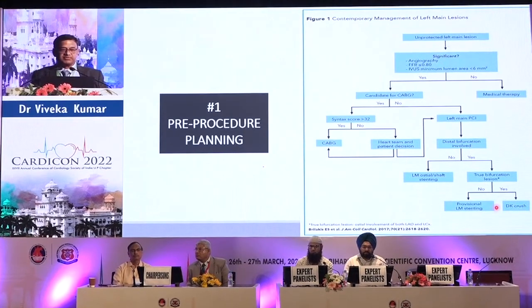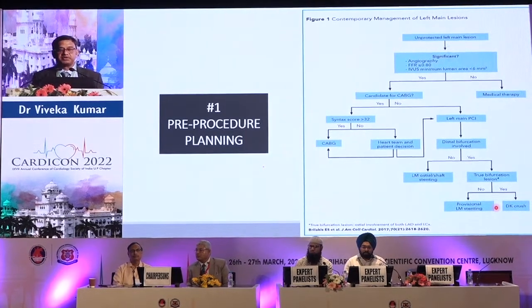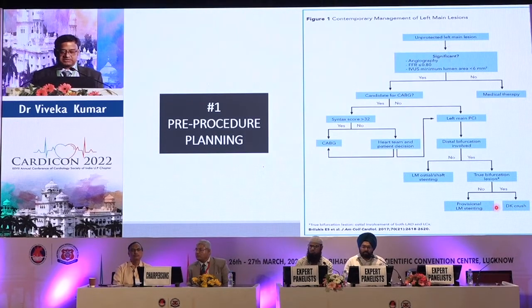We always say that when we have to do an intervention, we really need to do procedure planning, because as has been said, if you fail to plan, you are planning to fail. Similarly, if you don't have a strategy, it means disaster would happen on the table. The mother of all bifurcations is the distal left main bifurcation, and that's the problem where we need to focus maximally.